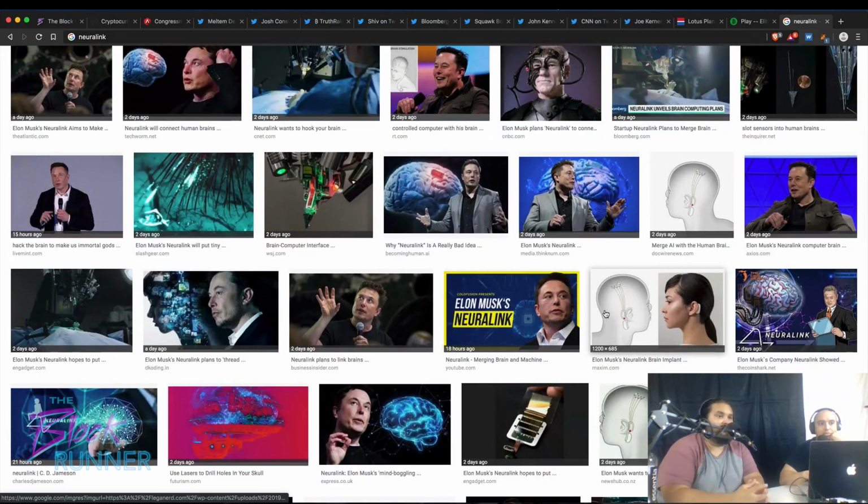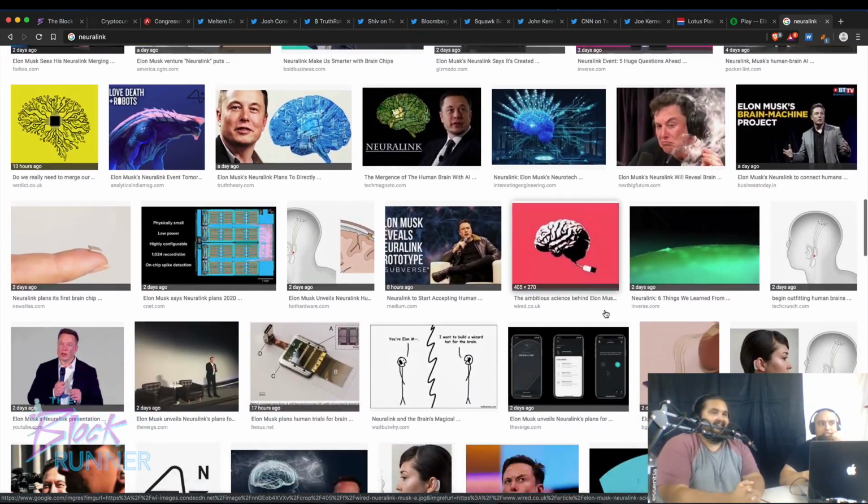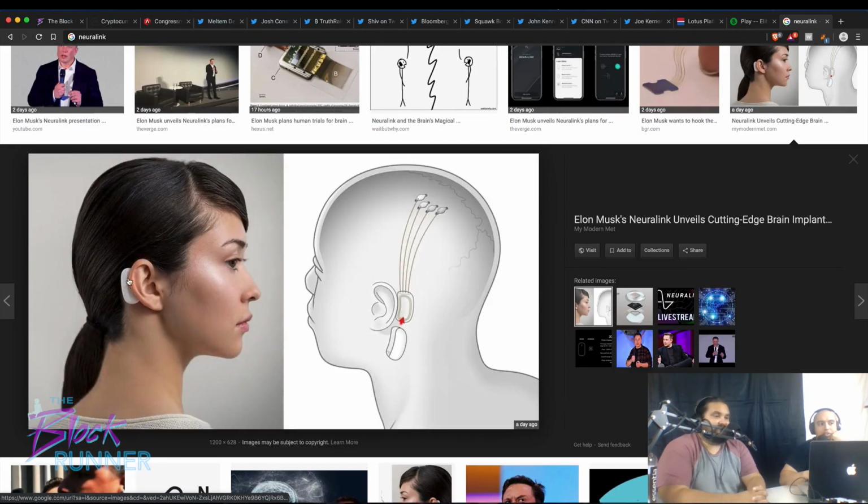Well, the device itself will just be something behind your ear, right? No, I'm talking about there was one image of the old school version of doing this that had two major spikes. I didn't see that. And so this is sort of what I was talking about. This is the wireless communicator, I think via Bluetooth, to your phone. And so you could just update, I guess, or swap out.